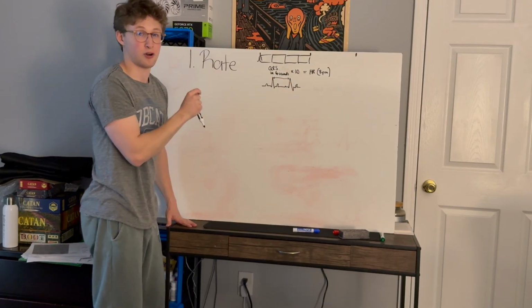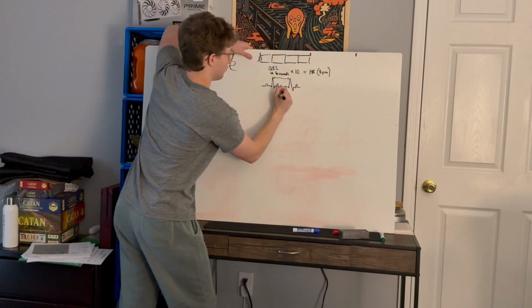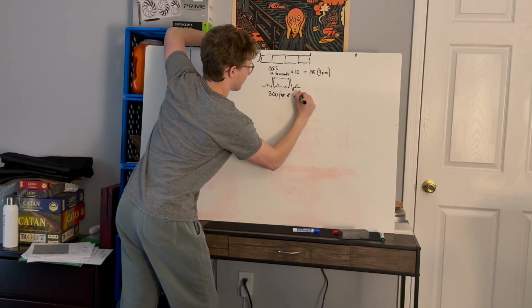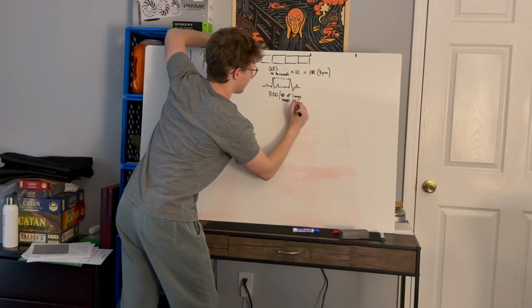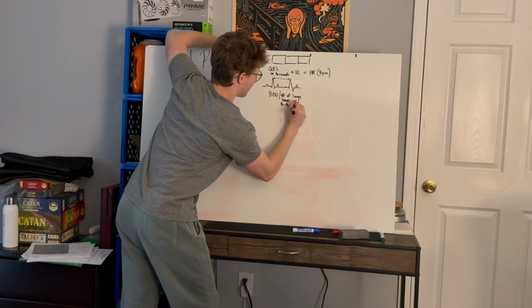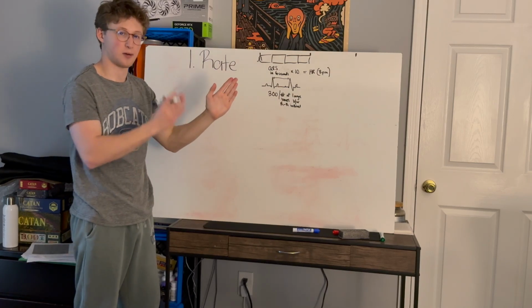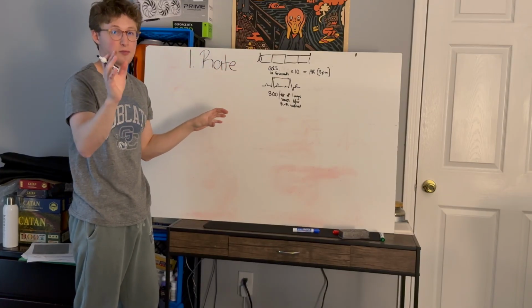You look at that R to R interval, you count how many large boxes there are, and then you take 300 divided by the number of large boxes between the R to R interval. Other way to say it, the number of large boxes between one QRS complex and the next. 300 divided by the number of those large boxes is a rough estimate of heart rate.